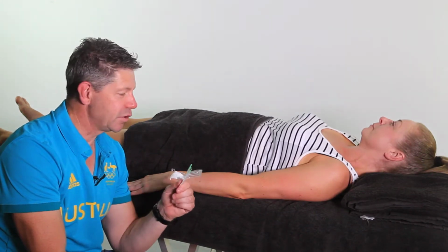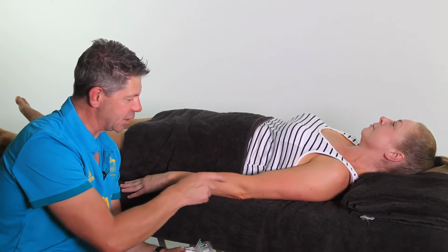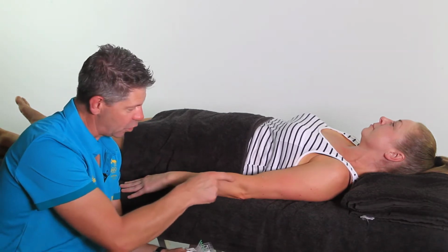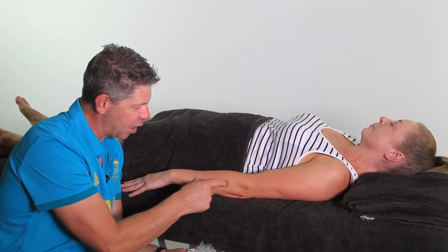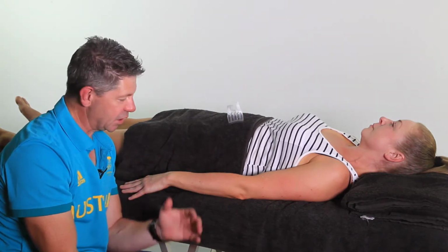All right, we're going to do some myofascial trigger point dry needling onto the extensors here for this lateral elbow pain. So as I've mentioned before, we are going to target or look at treating and needling this extensor carpi ulnaris. So in terms of having to find extensor carpi ulnaris, it's quite simple.